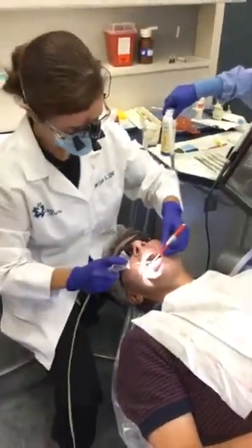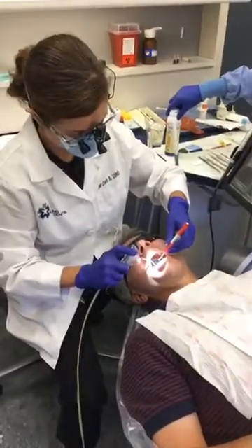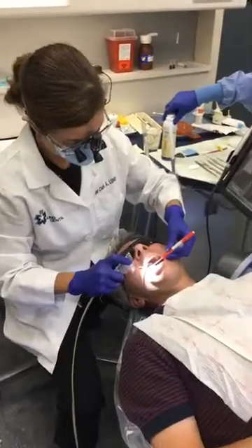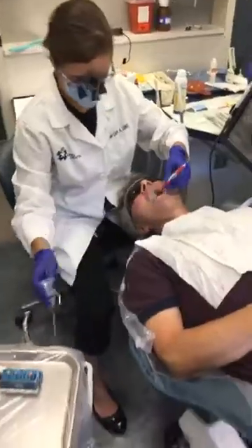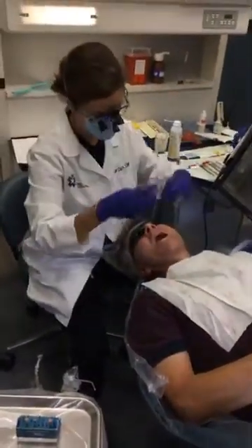So right now on London to Live, Dr. Cara is prepping to scan for the digital crowns. The tissue looks terrific, everything looks good. Let me do the scanning — you have to turn off the lights so it doesn't interfere.